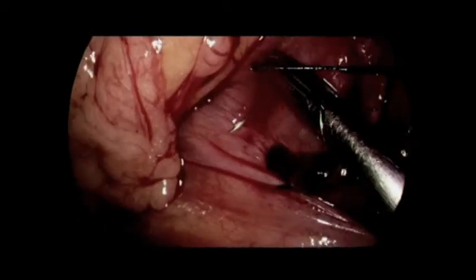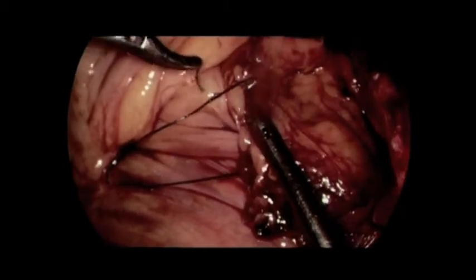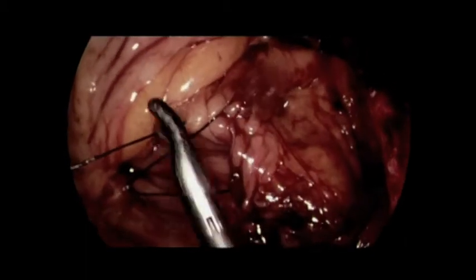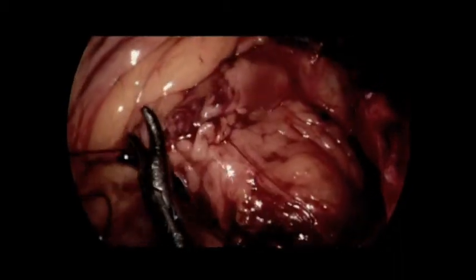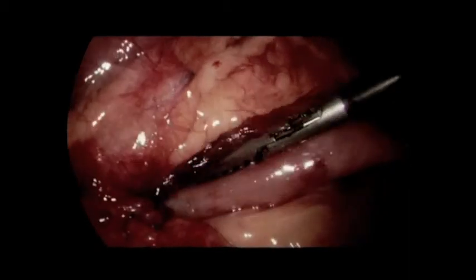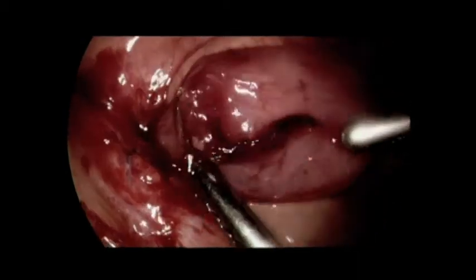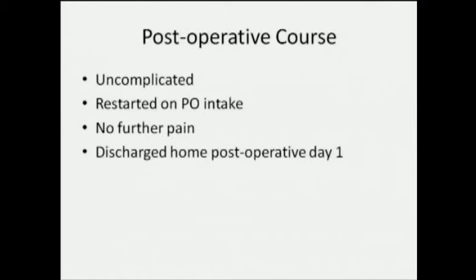The small bowel was then reduced and Peterson's space was sutured closed. She was restarted on oral intake and discharged home on post-operative day one.